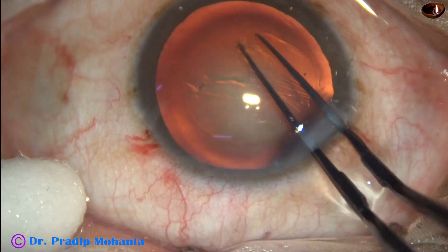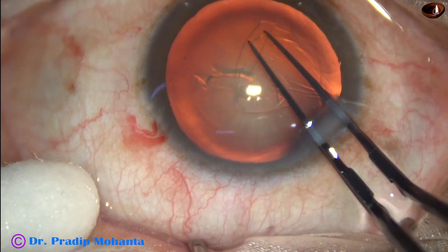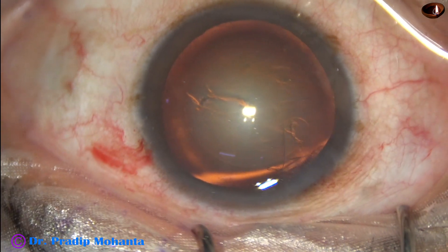A capsular tag is raised. This capsular tag is guided anti-clockwise all around, keeping a certain distance away from the pupillary border to complete the capsulorhexis.